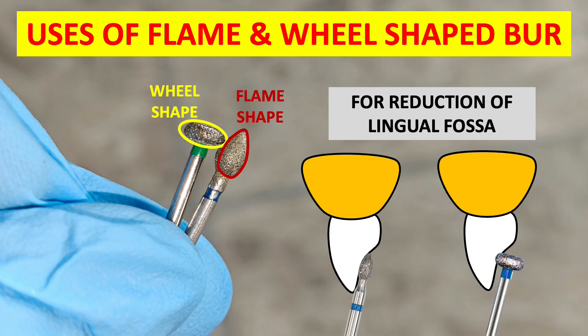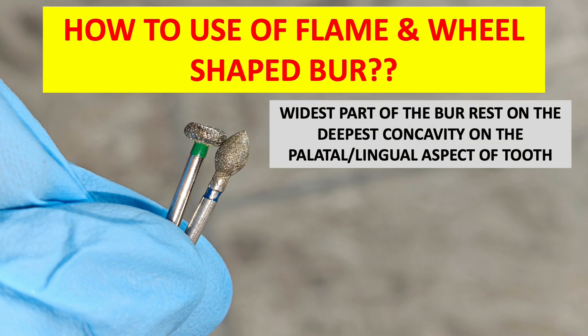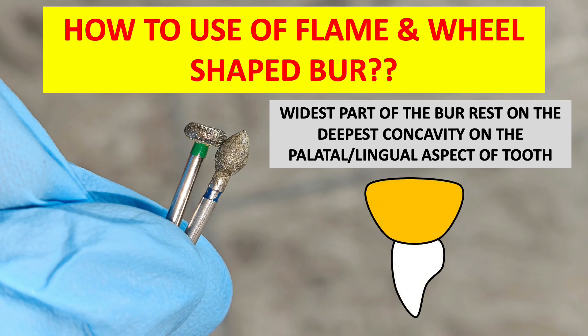How to use the flame and wheel shaped burs: the widest part of the bur rests on the deepest concavity on the palatal and lingual aspect of the tooth. As you can see in the figure, the lingual fossa is in a concave shape on the palatal or lingual aspect of the tooth, and the widest part of the bur should be placed on this concavity to reduce the cingulum. The remaining burs used in tooth preparation are discussed in Part 2.